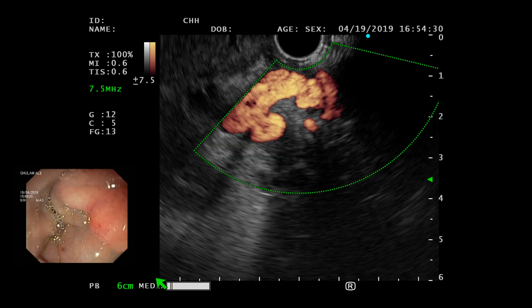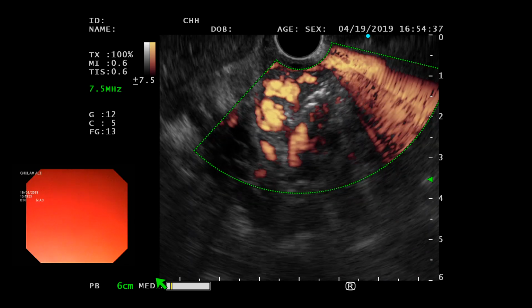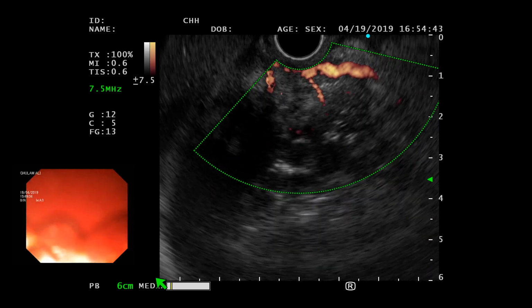Can you guys see the specimen? Yes, we can see that specimen. So these are all the cells there, which is viable tissue, and around those is quite a bit of necrosis. Thank you. ओके, ये अब आ गया, ठीक है ना?